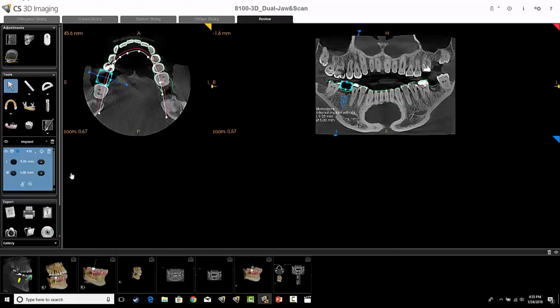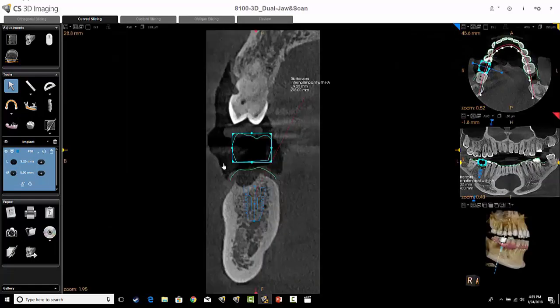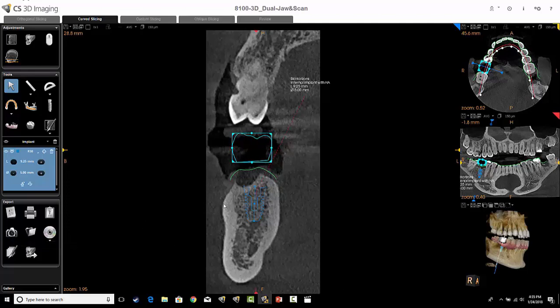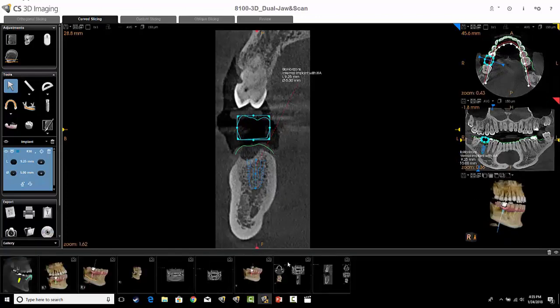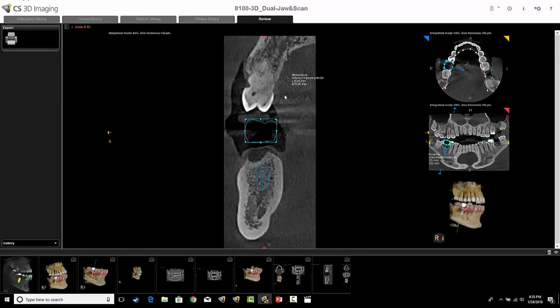Going back to the curve slicing tab — another option is if you wanted just an individual image, you can maximize that screen and also use that camera icon. It's still going to give you everything on the screen with that image a little bit larger. Down in the gallery, you can see this image is now captured. The cross-sectional view is larger but you still get the orientation views on the right-hand side.